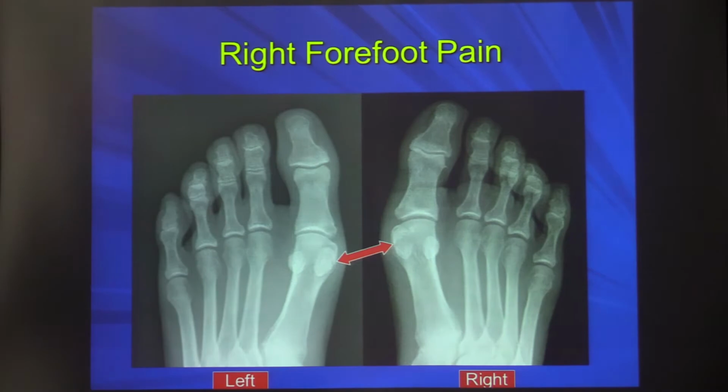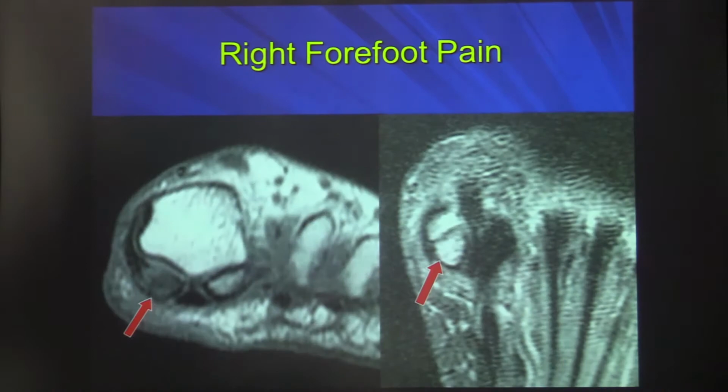You can see how large the tibial sesamoids are in this patient bilaterally. If you look closely, on the left there is a small cleft, but on the right the cleft is widened. And this is what can happen when direct trauma occurs to a bipartite sesamoid, or, as I'll discuss in just a moment, when an injury occurs putting tension on the sesamoid, you can diastase the two fragments, and that would be in the setting of turf toe injury.